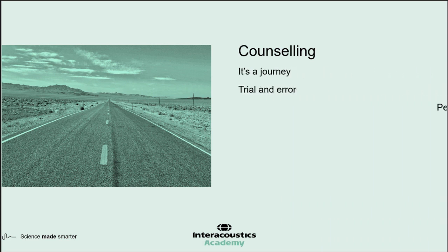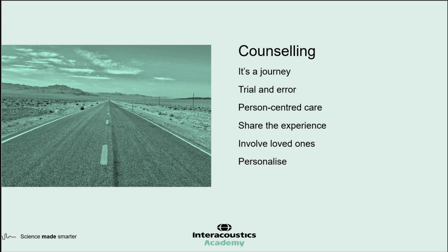Now, counselling, obviously the title of this section is how can technology help improve the hearing aid fitting? But I want to touch on counselling because I feel that counselling is not exclusive to technology, and actually the two need to go hand in hand and can go hand in hand really nicely. With any patient, it's always a little bit of a journey. With more complicated losses, more challenging profiles, there's definitely an element of trial and error. We're rarely going to get it right first time round.